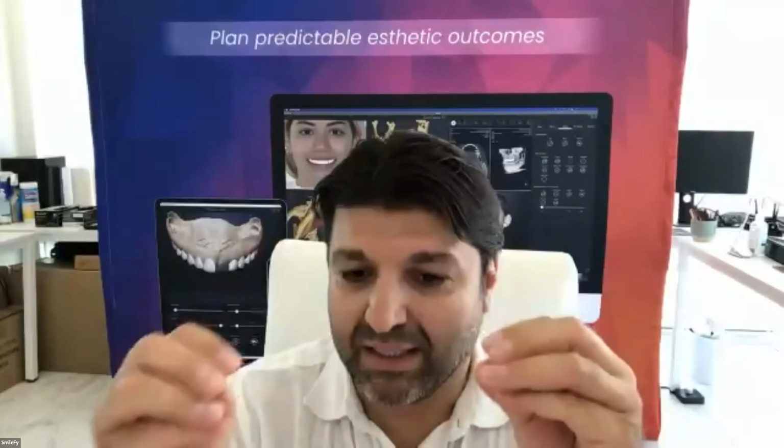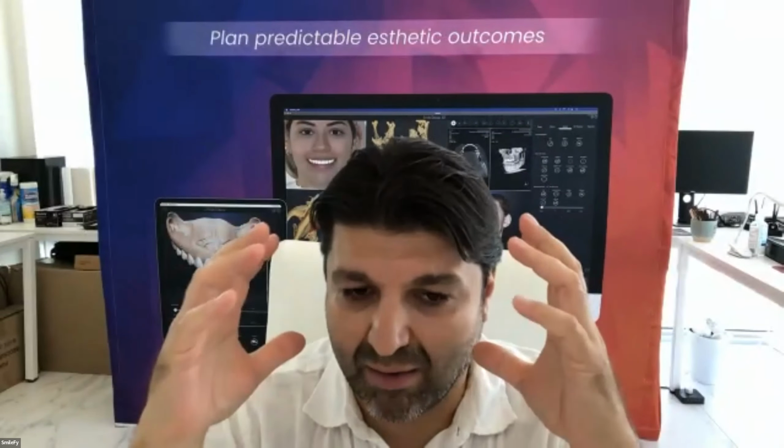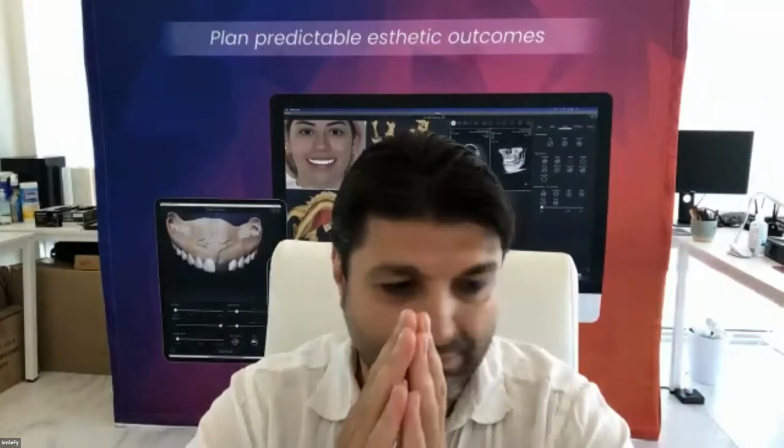So you can really go now into detail and say, I do have my templates, but I want to create something so personalized and so customized for my patient that nobody has. You have the tools, and the big goal was, no matter what we do with our templates, we keep the natural quality of the morphology forever.